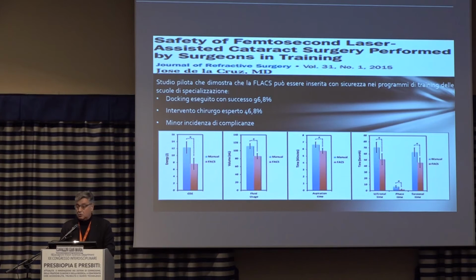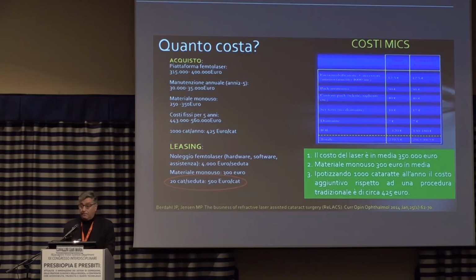It's a safe procedure, as witnessed by this publication where residents were involved. They found that the risks are not higher, but mind you, in 46.8% of cases, surgery was done in expert hands. There were no difficulties with docking, and compared to the conventional technique, there were less complications.